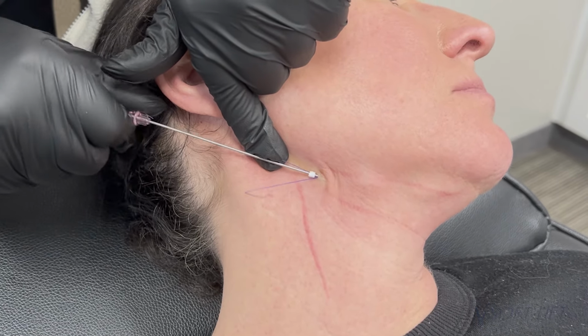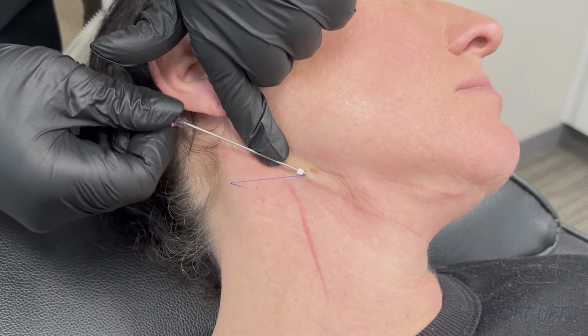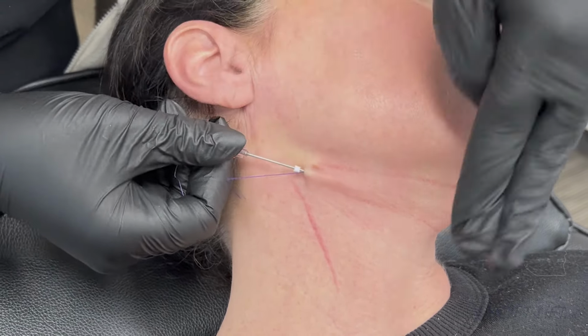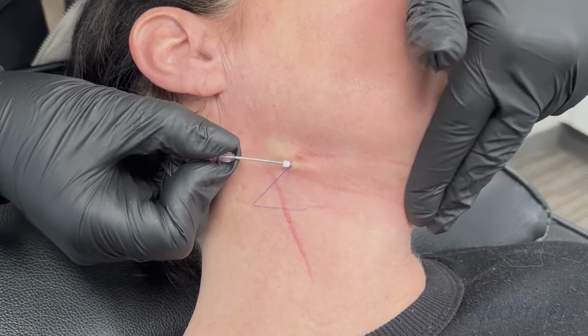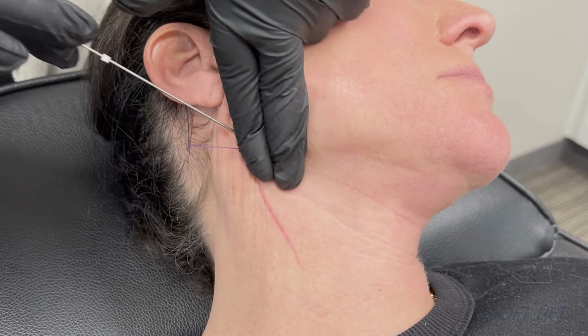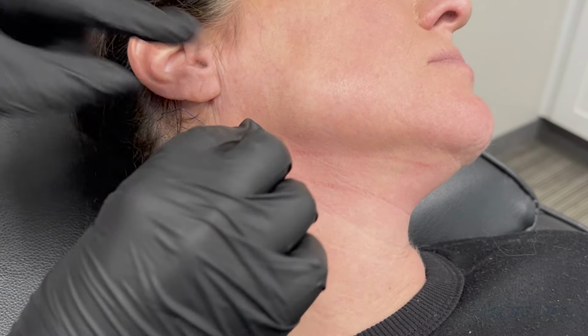So get it in, push a little, check my depth, push a little, check my depth, and I do that the entire way down. And as you can see, when you're in that proper plane, it really does glide in really nicely. Then putting gentle pressure on the distal end, ensuring the thread stays in, and forcing and exaggerating that skin back in the direction that I want it to pull.